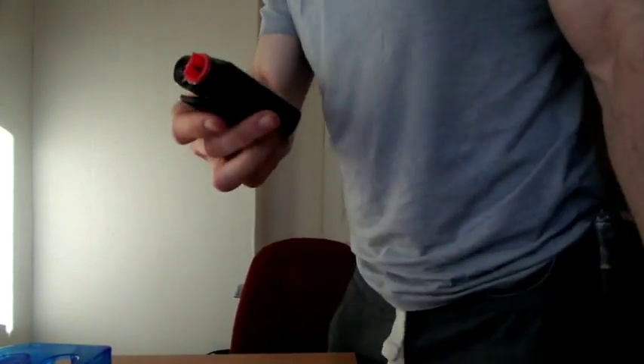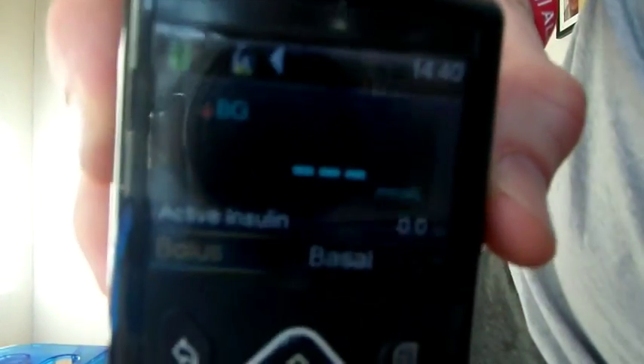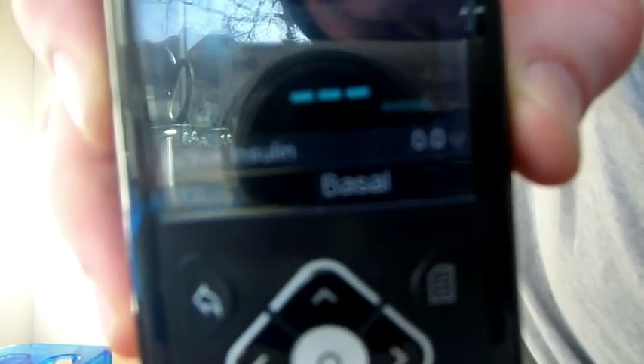The first thing I notice is certainly the screen is a lot clearer. You have better icons on the top — an insulin bottle, a battery — and then your blood glucose in the middle, quick access to the basal and bolus. On the right-hand side there's actually a menu button, so you can just go straight into the menu. Then your up, down, left, and right, the select button in the middle to choose the option you want, and the back button. Looks pretty straightforward.